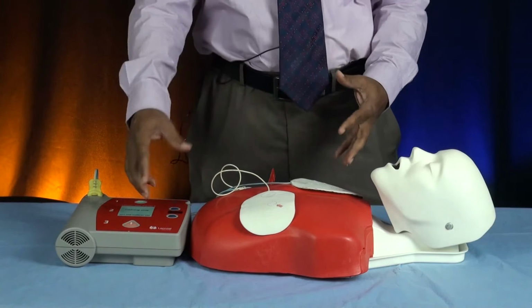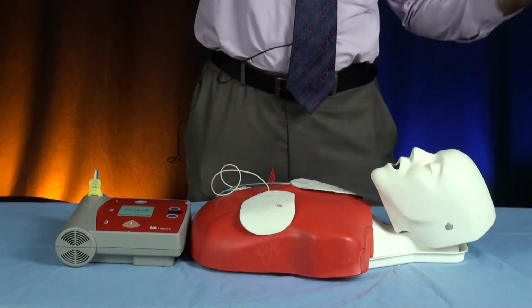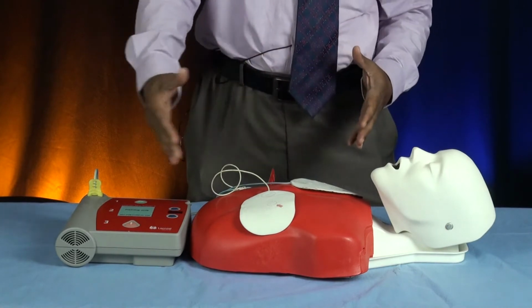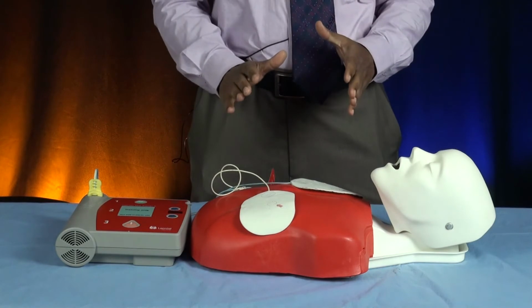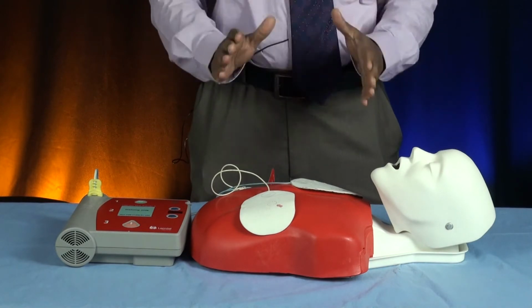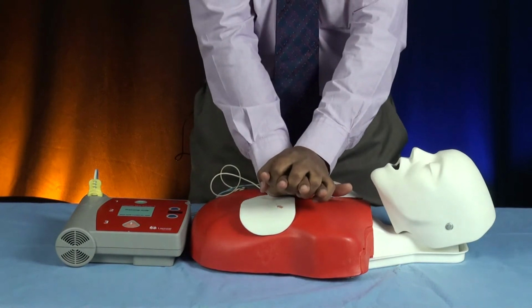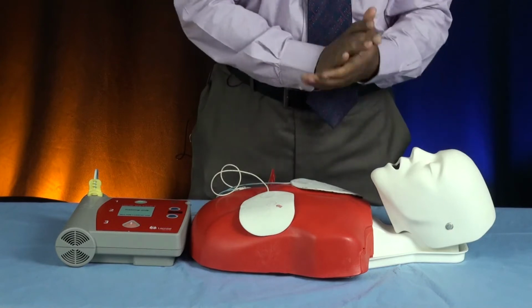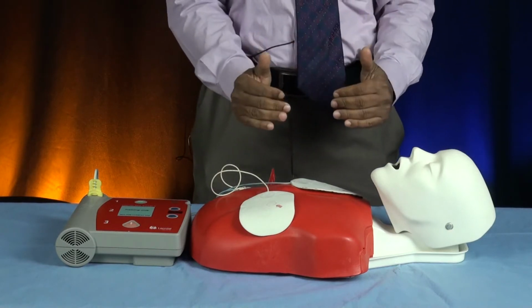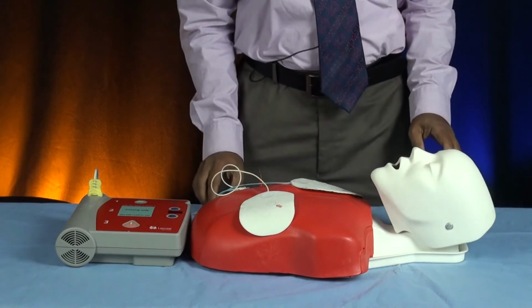Once the shock is delivered to the victim, the muscles will jerk. This means that you delivered the shock to the victim. Immediately after this shock, do CPR with 30 chest compressions and 2 breaths. After 5 cycles of CPR, again check for pulse and for breathing.